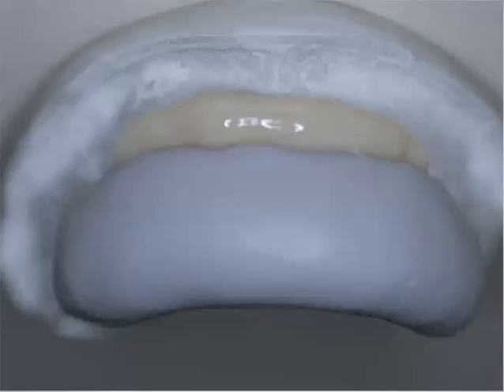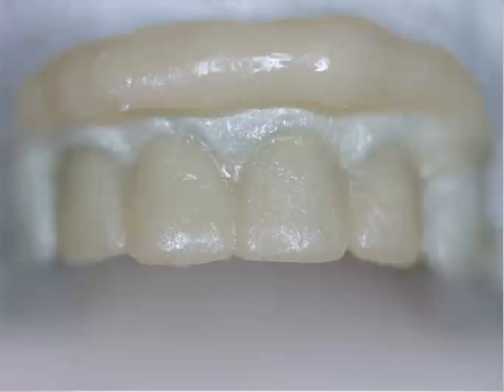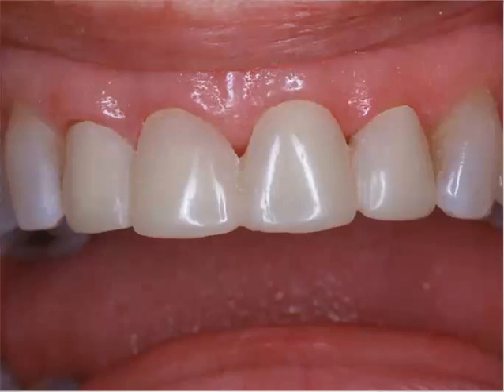From our preoperative wax-up, we can make a putty stent, a VPS putty stent form. We can actually produce our provisionals on a model if you don't want to do it intraorally, because there is some minor shrinkage. These are BIS acrylic resin, very hard, easily polished, very durable provisionals, which will allow us, during the time of provisionalization, which may be anywhere from a week and a half to 2 weeks, the stability to maintain those teeth in the proper arch form.